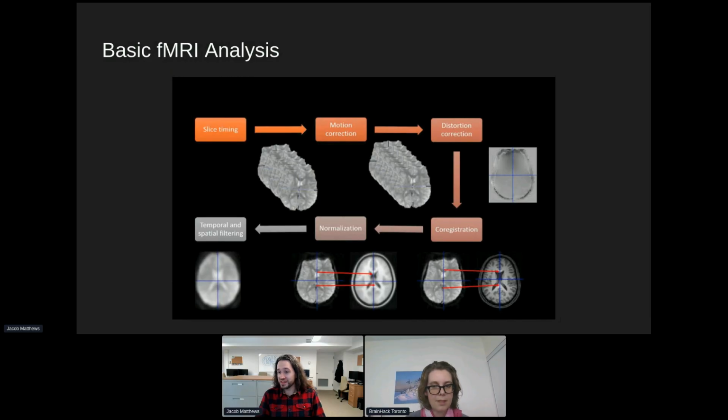That's a growing field, and I think a very important field, because quantitative MRI has been very difficult to do for a long time. Usually the sequences are just long to acquire, so they're not practical clinically. And even in research, we tend to balk at the time requirements for some of them. But as we find ways to do these things faster, for example, some MR fingerprinting techniques, which is a very new, novel MRI method, some fingerprinting techniques can essentially give you quantitative outputs, and you can do them very quickly. So these will definitely be increasing on everyone's radars in the years to come.